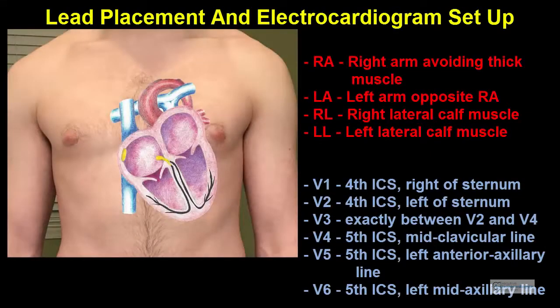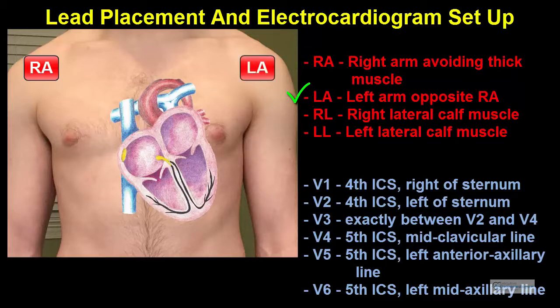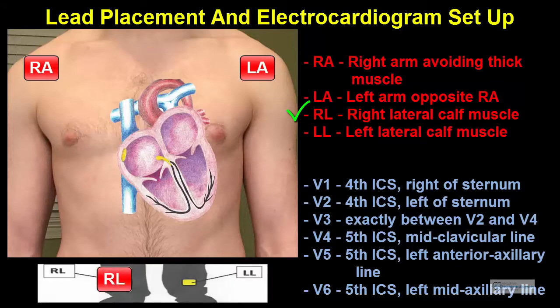The electrodes are placed as follows. RA, or right arm, is placed on the right arm, avoiding the thick muscle. LA, or left arm, is placed on the left arm in a similar place as the RA electrode. RL, or right leg, is placed on the right lateral calf muscle. LL, or left leg, is placed on the left lateral calf muscle in a similar place as the RL electrode.